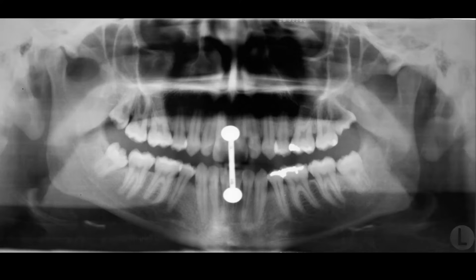Foreign bodies are easy to identify. Many times, foreign bodies will create ghost images. So let's not discuss ghost image now, but we'll try to identify some of the foreign bodies. If possible, we'll try to remove the foreign bodies before the exposure. The tongue piercing may not be easy to remove during panoramic radiography.